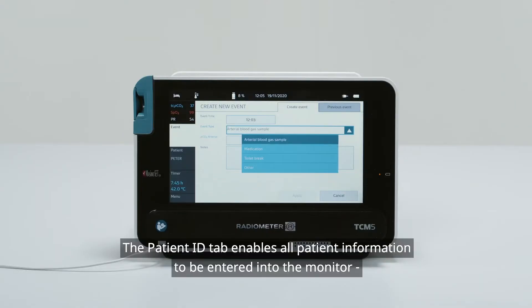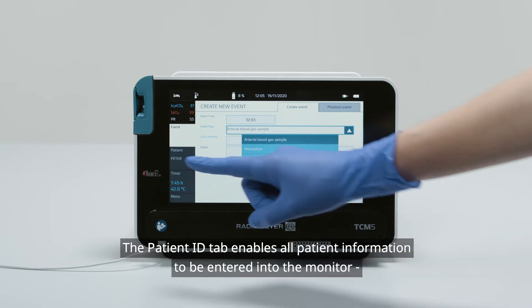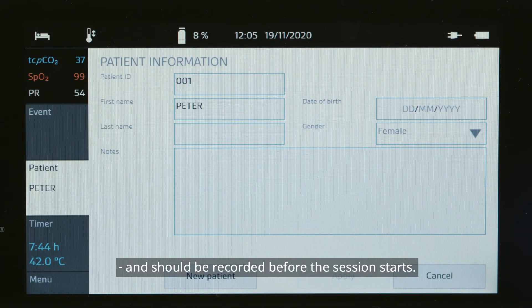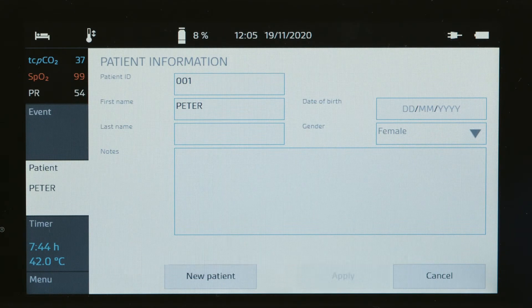The Patient ID tab enables all patient information to be entered into the monitor and should be recorded before the session starts.